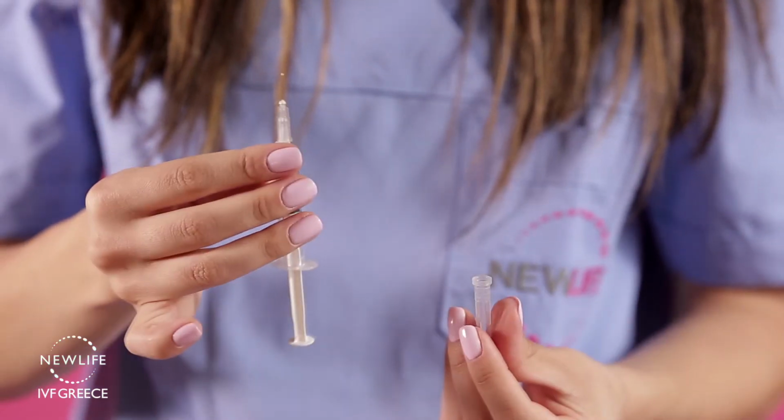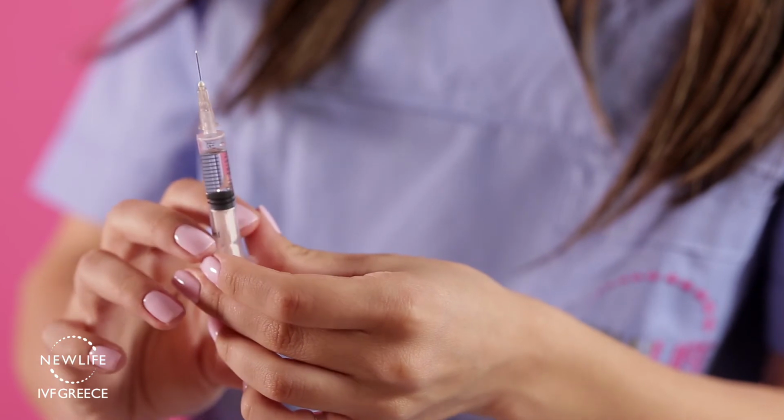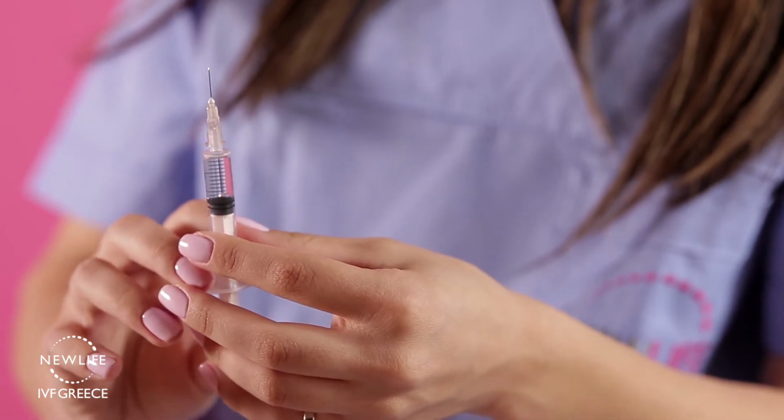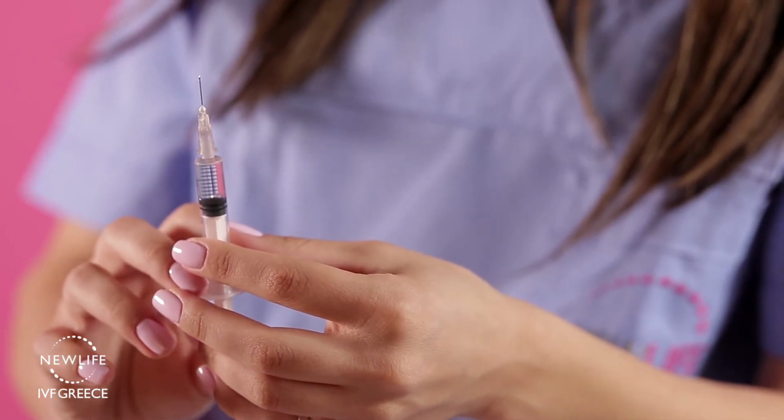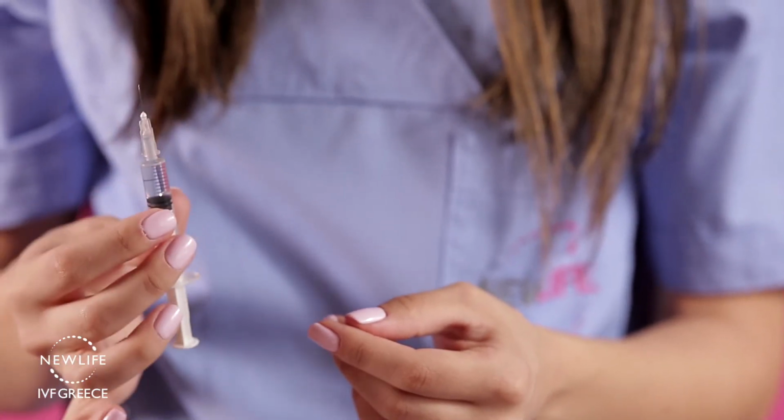Attach the small subcutaneous injection needle. Hold the syringe with the needle pointing upwards and tap it gently until all the air rises to the top. Press the plunger slowly until the air is removed and you see a small drop of liquid forming at the top of the needle. You are now ready for your injection.